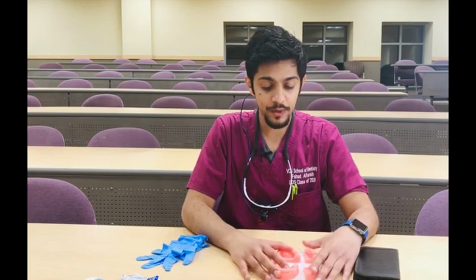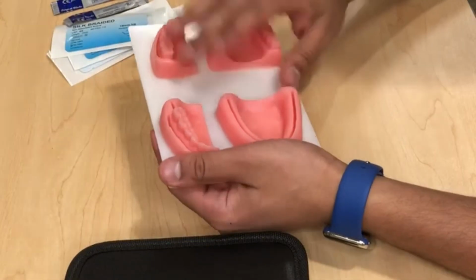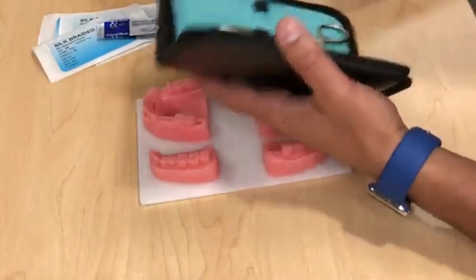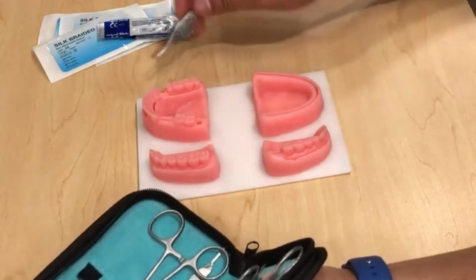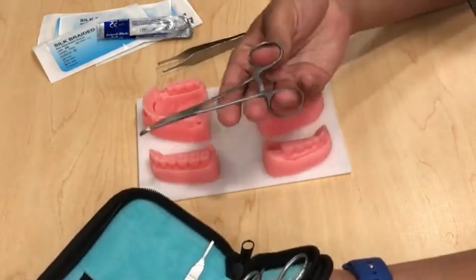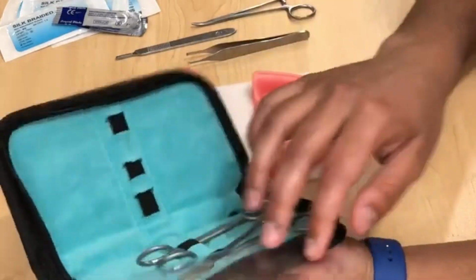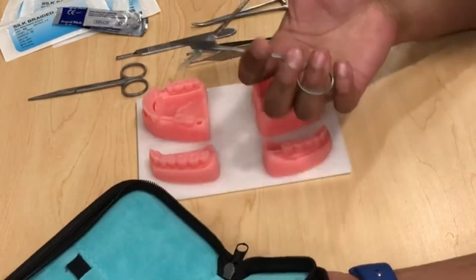Okay guys, so we've got our oral cavity model here. It has some sockets, extraction sockets, big flaps here, and we have our kit over here with all the instruments you need. So we have the Addison's tissue forceps with the teeth. We have our hemostat. We have our blade holder. We have our scissors, and we have our needle holder.